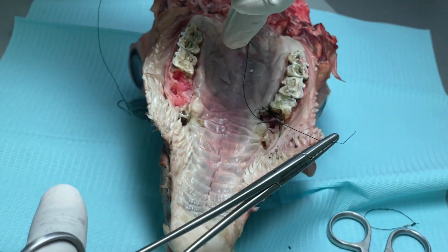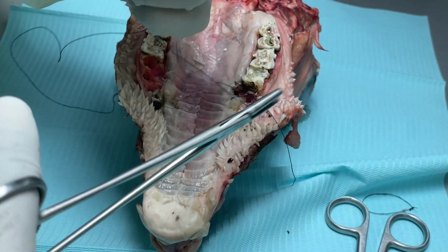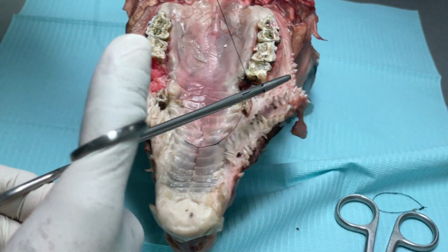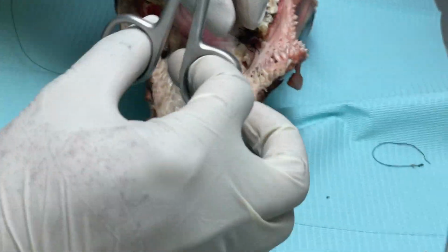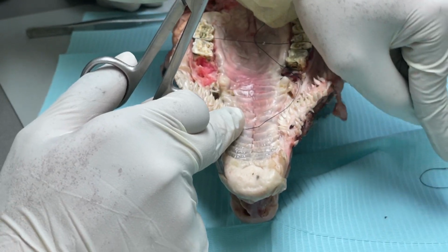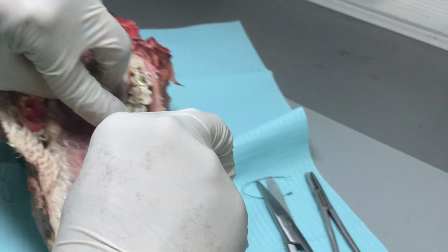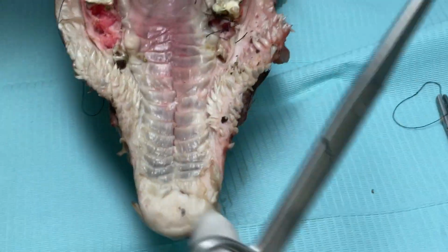It shouldn't come to this side. This tissue is, that's why it's coming like that. Okay, and again one more, on the buccal side. This knot should actually come here. Is there a certain way to guide the knot? Yes, when you're pulling it, push it towards that side. When you're tying the knot, keep your finger here, and if you push it here, it will not go there. I will show you when you are doing it. I will be with you.